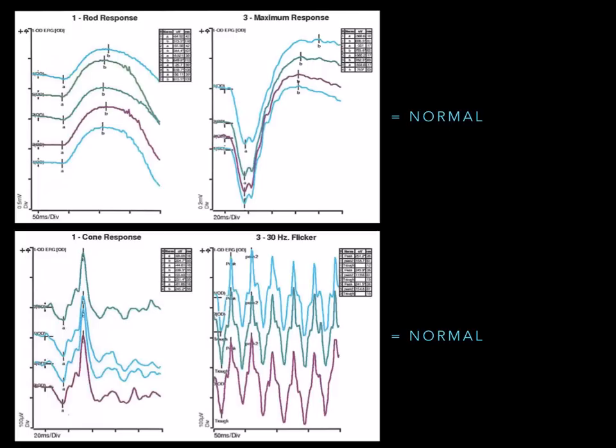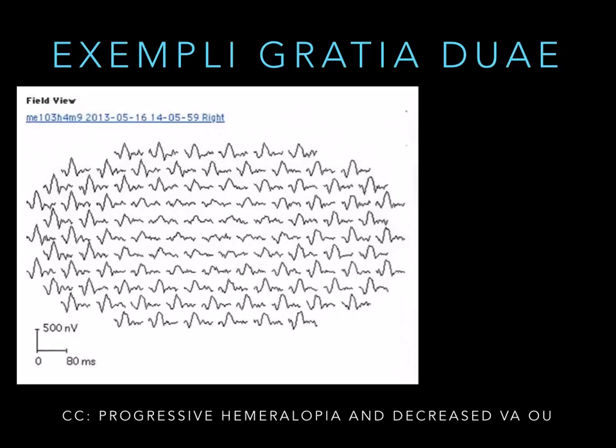Cone dystrophy affects all the cones. And again, you've got the highest concentration, 140,000 per millimeter squared. I don't know why I remember that. You guys probably don't remember that, but I just gave a lecture. 140,000 per millimeter squared in the center. That's 745. But 90% are outside of the fovea. I think they're outside of the macula even. His multifocal ERG, little squiggles in the center, are smaller little mountains and valleys in the outer portion. So his multifocal is abnormal, right?